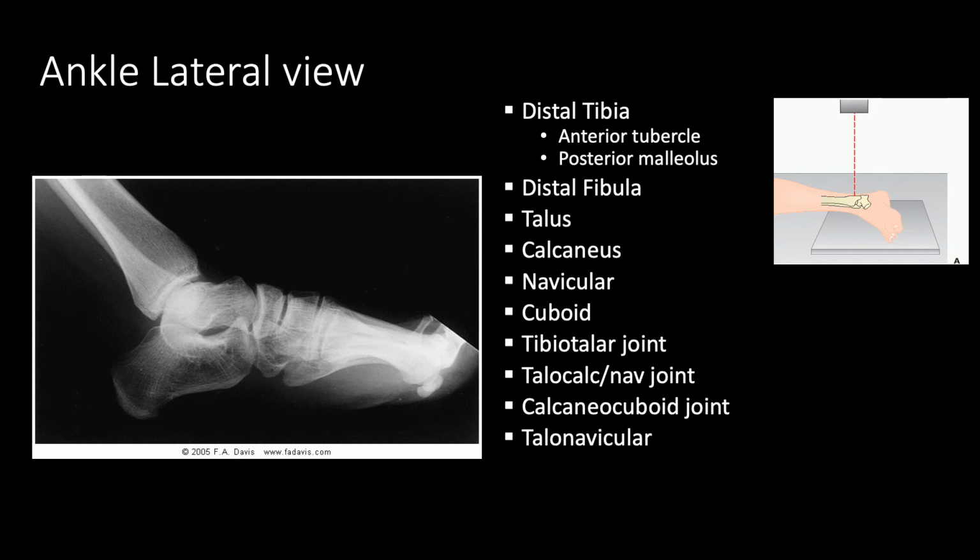So here you see the way the ankle and foot is on the table, the x-ray beam shot through here, and the film underneath the foot and ankle.